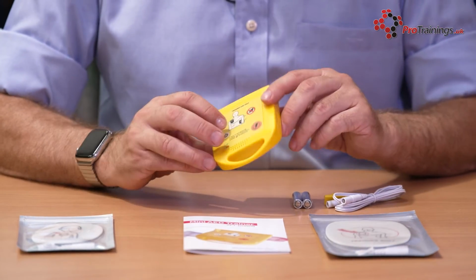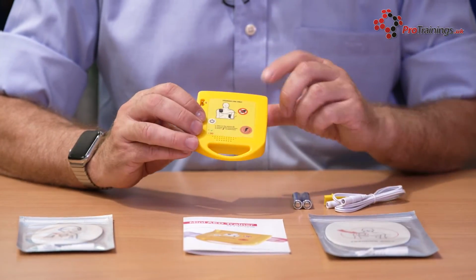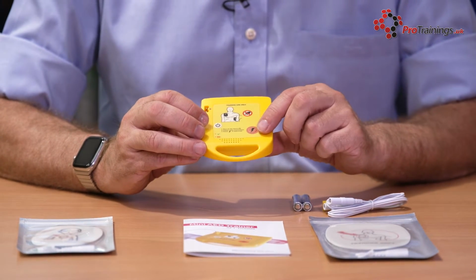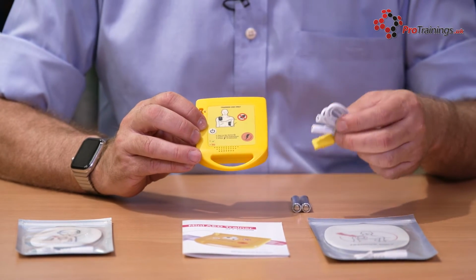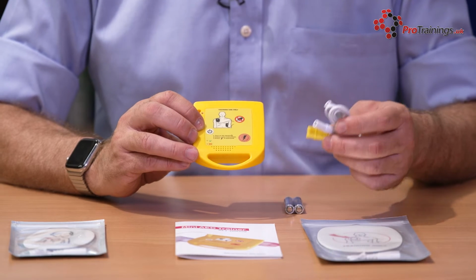So when you're using this unit, you first put batteries in the back, just undo the 2 screws at the top, pop the batteries inside it, and then once you've done that, hook the pads up. And the key thing is you'll turn the unit on using the on button here. It activates so you get the students to put the pads on first. They put the pads on.